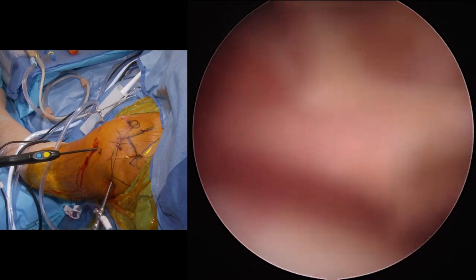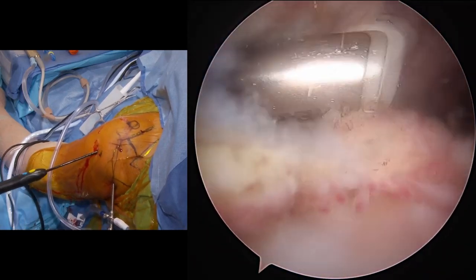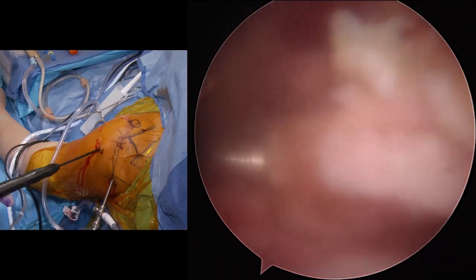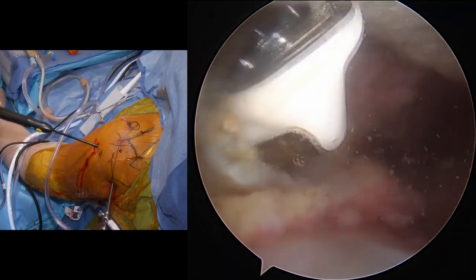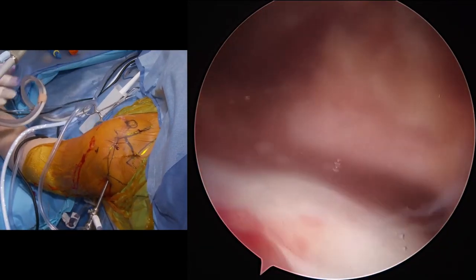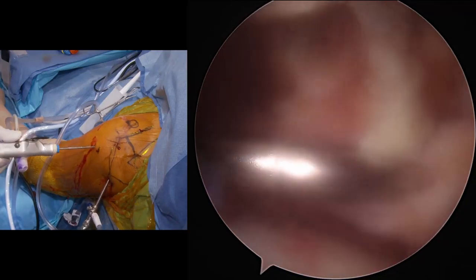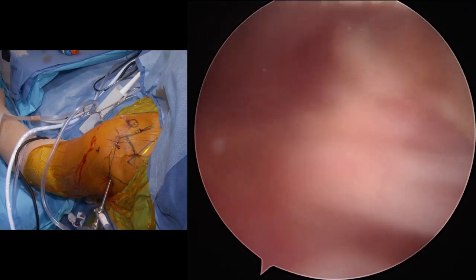It's just not accomplishing the task with what we have. Let's go up to 60 on our pump. All right, let's have our shaver. Do you have the more aggressive shaver? I think we need that now. Thanks.